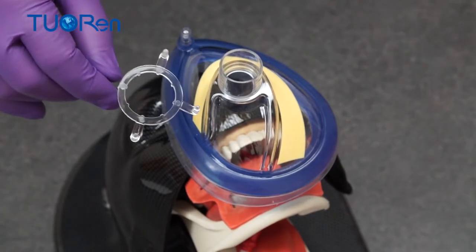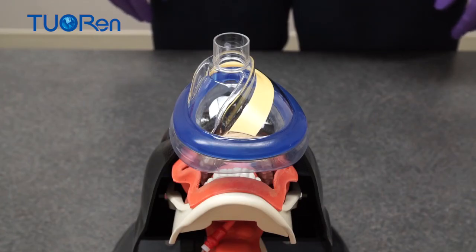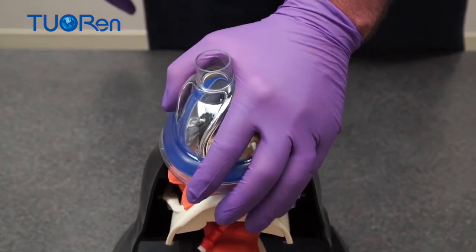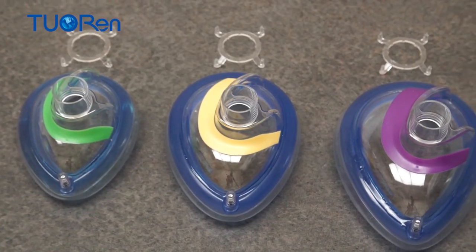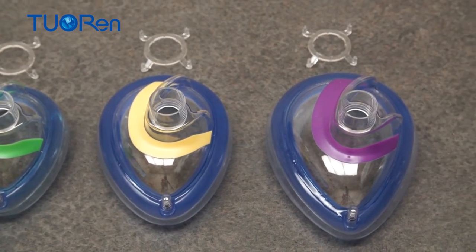The strap holder is available and can be used when needed. Using an ergonomic mask, a standing or kneeling rescuer can easily adopt both the one hand and the two hand techniques. The ergonomic mask is available in three color-coded sizes: small, medium and large.